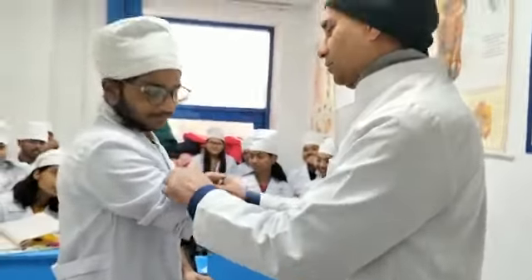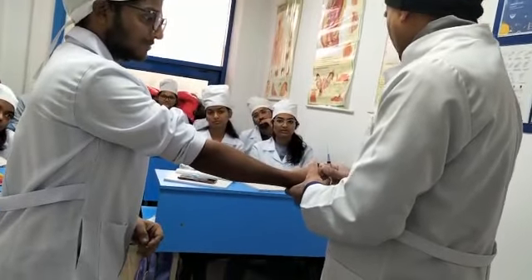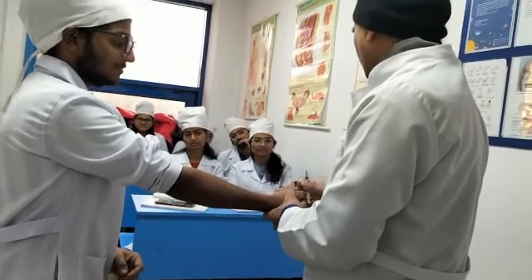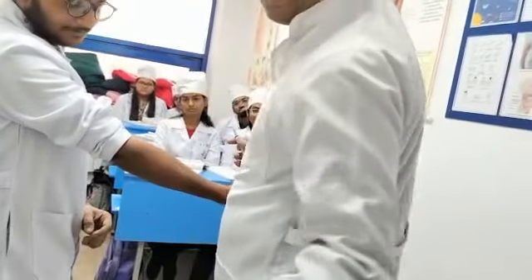You must use a 22 gauge needle here. Ask the patient to close their palm into a fist. With the help of that, you can find the vein.